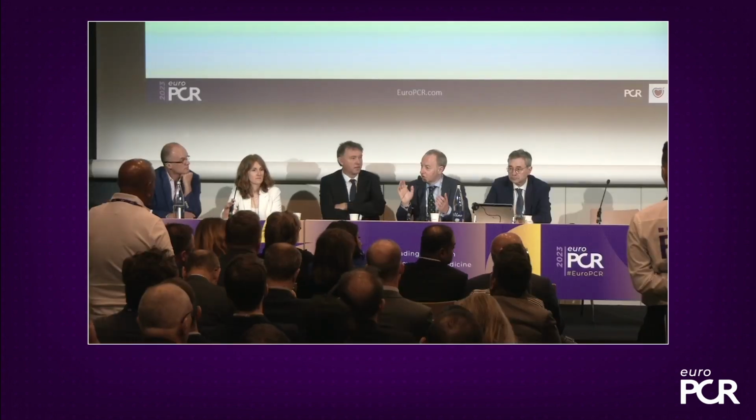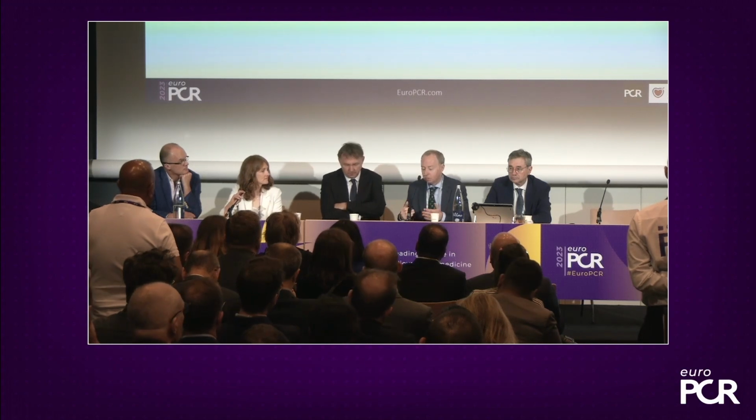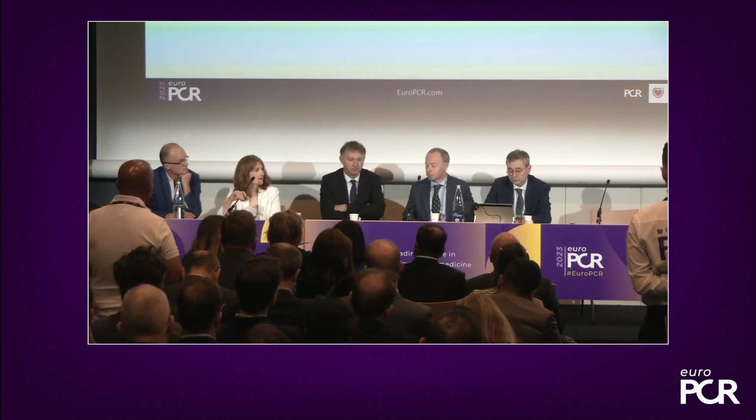Thank you. So for all elective work, dual antiplatelet therapy for a month. For ACS, we're treating the patient rather than the lesion, so if you want to, up to a year. But you can stop it sooner from the point of view of safety of the lesion that you've just treated. I kept it going for 6 months just on that case because of that dissection. I just thought go a little bit longer, but you're right, it could have stopped earlier.